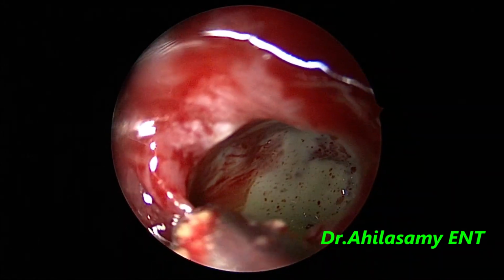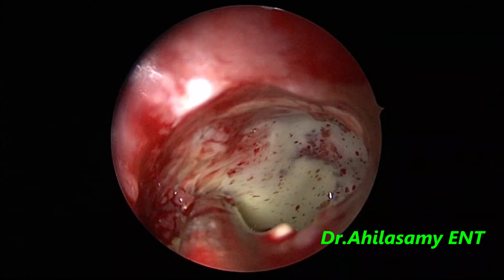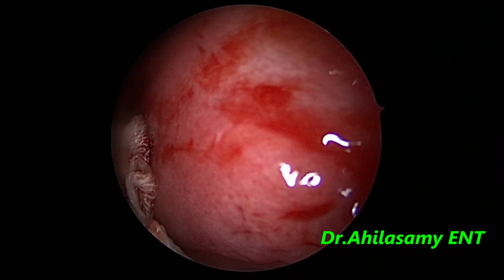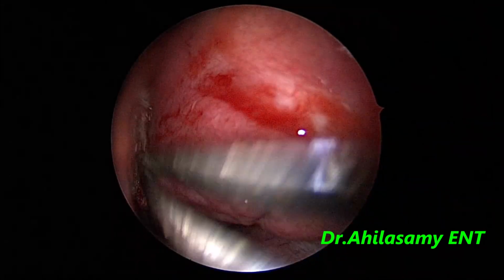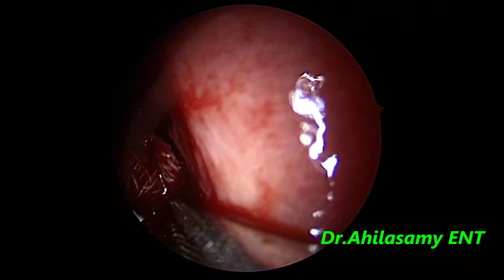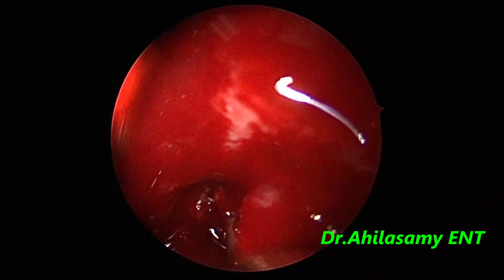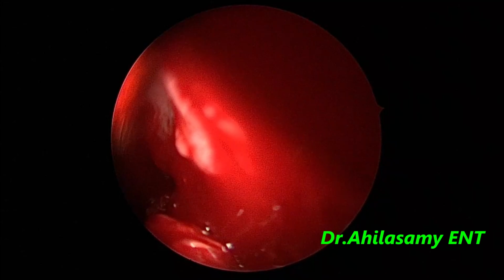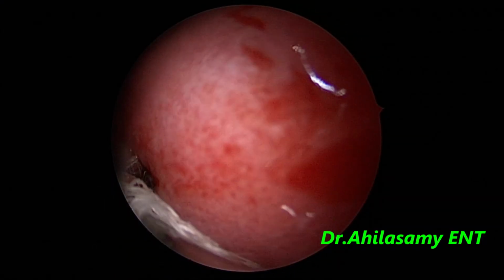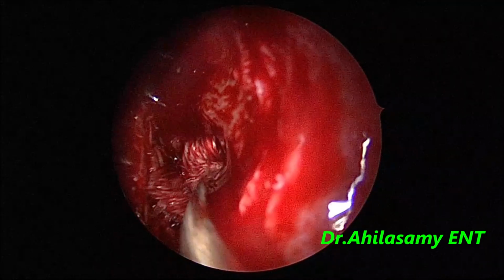Now all the fungal material is sucked out. There's a thin coating of secretions which will come out with the ciliary movement, but still I am using the wet mopping technique. Now I have come to the 70° telescope and I will put the roller gauze inside, roll it, wipe it and take out all the secretions. Do it once or twice. Again I am doing it for the second time. It's a 30-minute video edited to around 10 minutes.